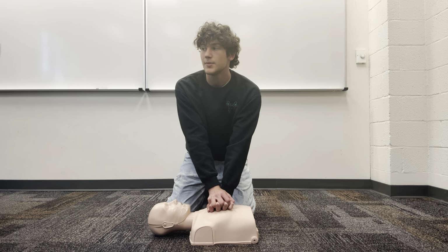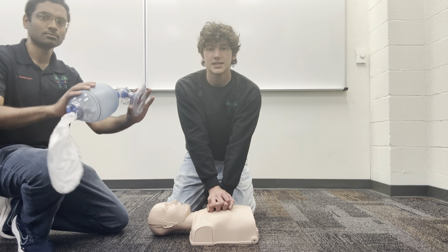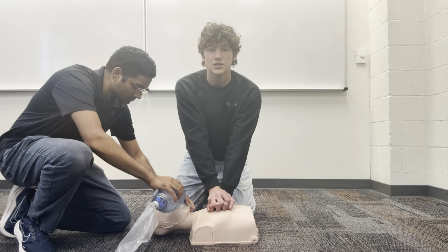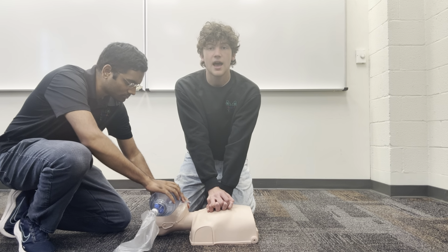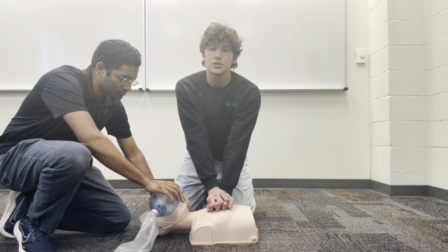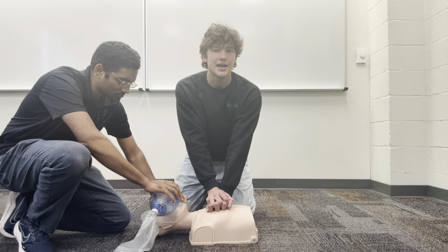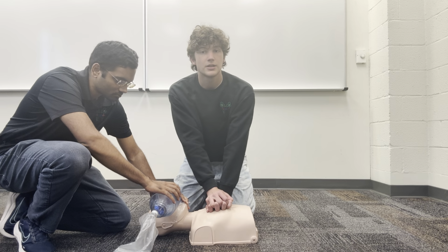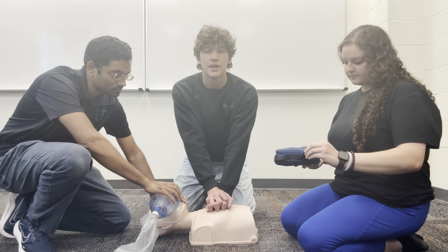Shri is going to come in with the BVM, or bag valve mask. This is used to deliver oxygen to the patients and attached using a CE clamp. You are going to ventilate until chest rise, opening the airway with a head tilt chin lift. We are going to rotate every 5 cycles, or 2 minutes. We are compressing in a 30:2 ratio of 30 compressions to 2 breaths, or in a multi-responder pediatric scenario, 15 compressions to 2 breaths. Then Taylor is going to come in with the AED, or automated external defibrillator.